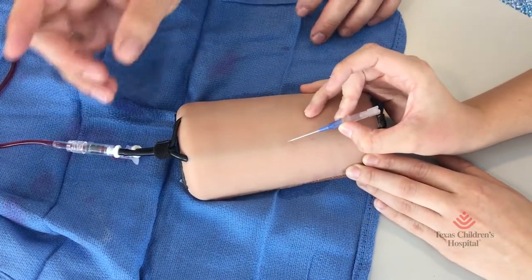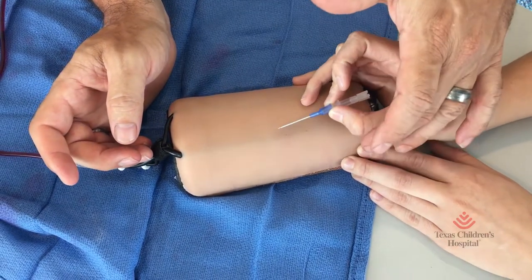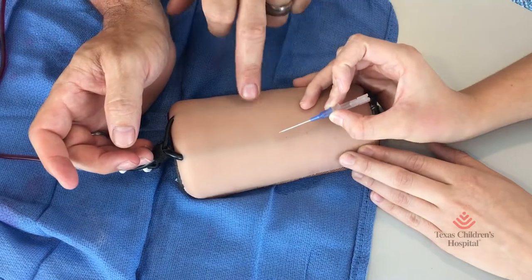You've got to become part of that patient because this guy is kind of moving. So your arm — you're going to mount that arm like this and then you're kind of moving with it. So don't try to hit the vein yet. Just kind of go right here.